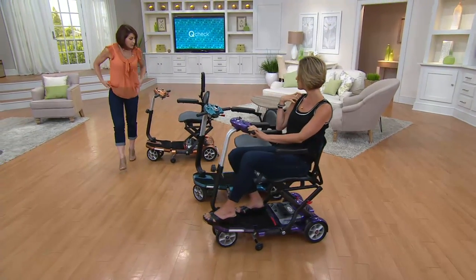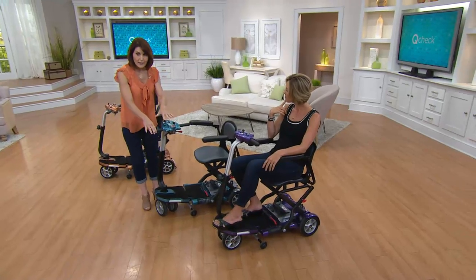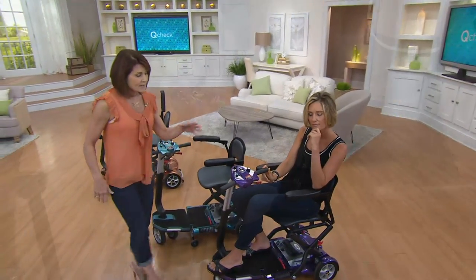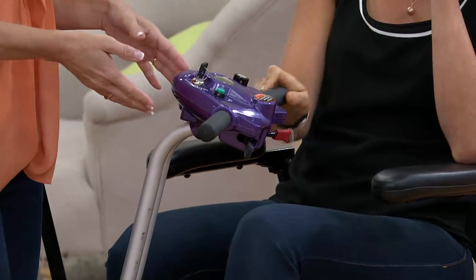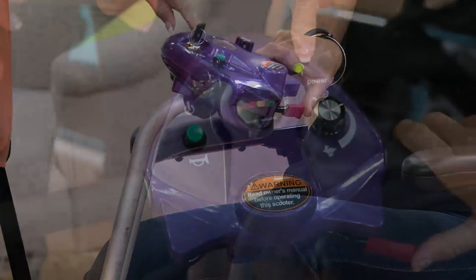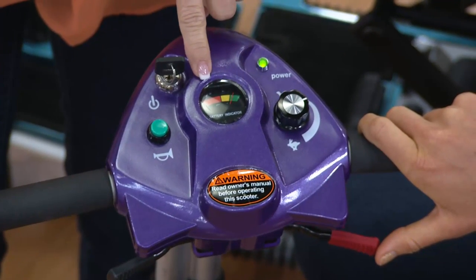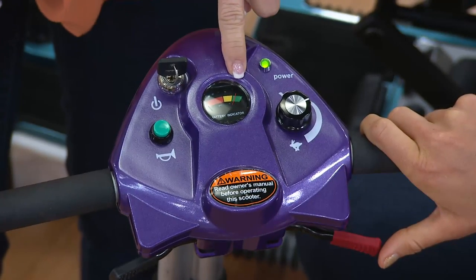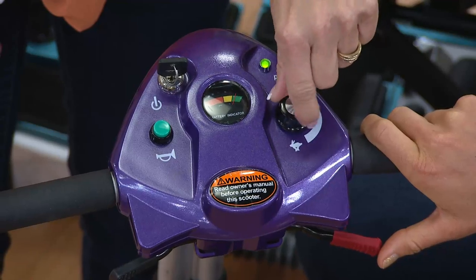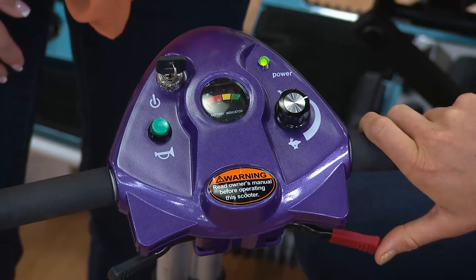It holds up to 250 pounds. The dashboard is so easy to use. You just see a simple key — when you turn the key on, you'll get two flashes to let you know you're powered up. The gauge is like a gas tank: red means you need to charge, yellow means you're getting low, green means you have power. We give you a horn. It doesn't get any easier than turtle and rabbit — this simple dial lets you adjust your speed while driving, up to four miles per hour.